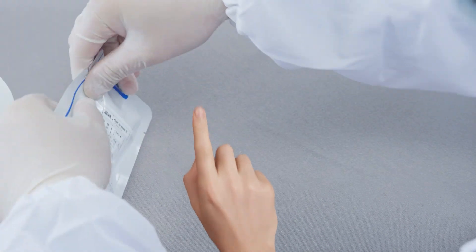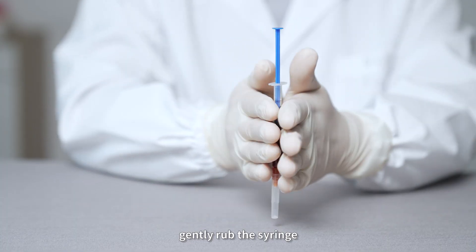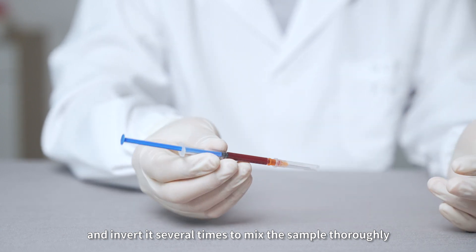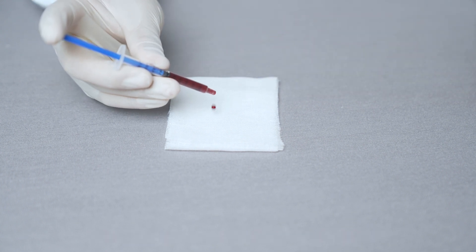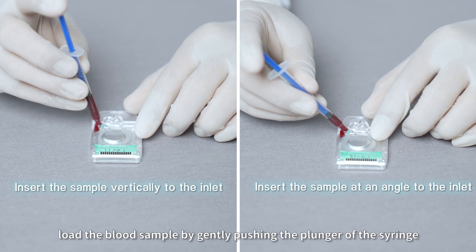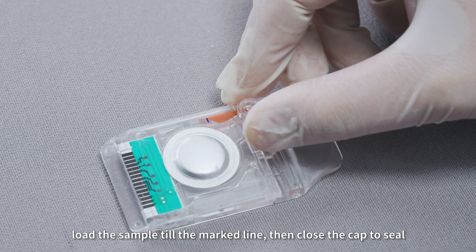Step 3: Sample Login. Remove the test cartridge from the packaging. Gently rub the syringe and invert it several times to mix the sample thoroughly. Discard the first two drops of blood before loading the sample. Load the blood sample by gently pushing the plunger of the syringe. Load the sample to the marked line, then close the cap to seal.